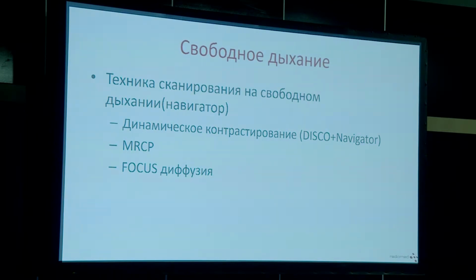Let's talk about free breathing imaging. You can perform a complete abdominal exam without a single breath hold command using navigator techniques. You can do this in combination with contrast agent dynamically. You can use it for MRCP or for focused diffusion weighted imaging.